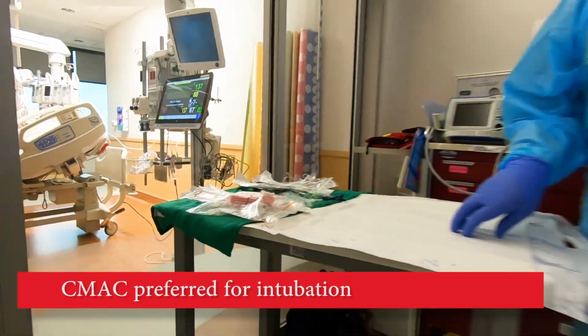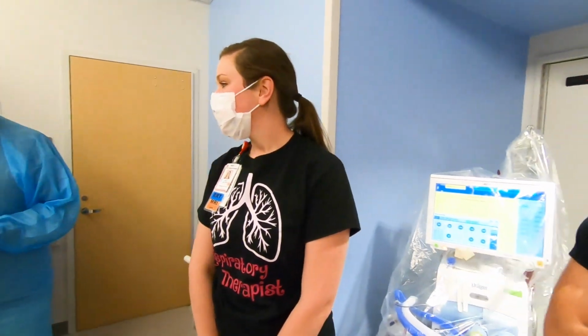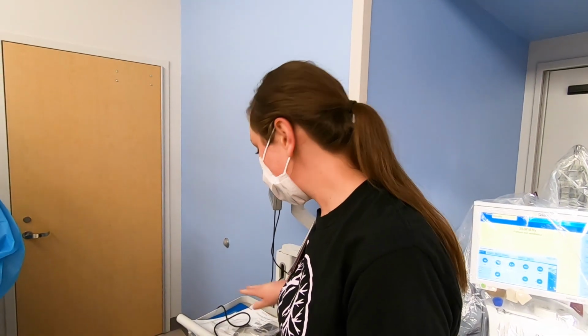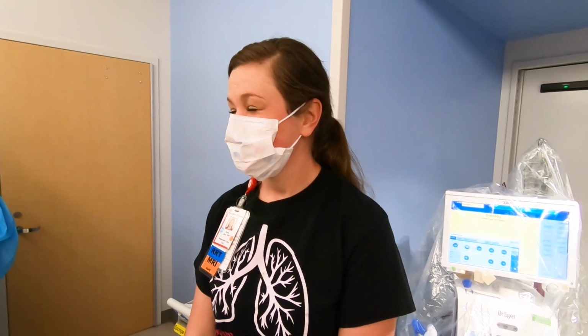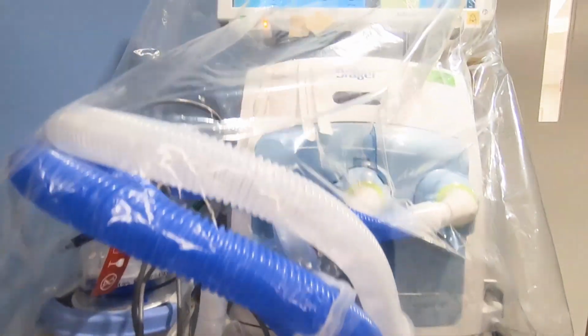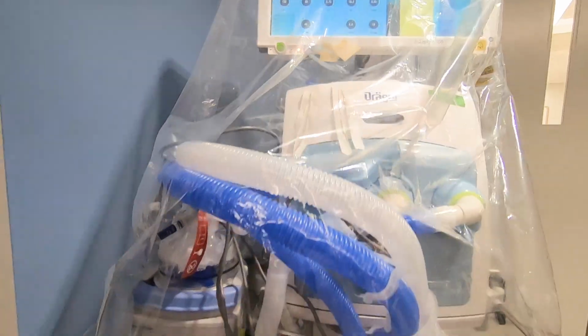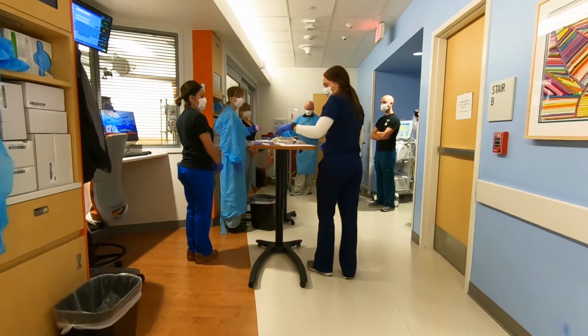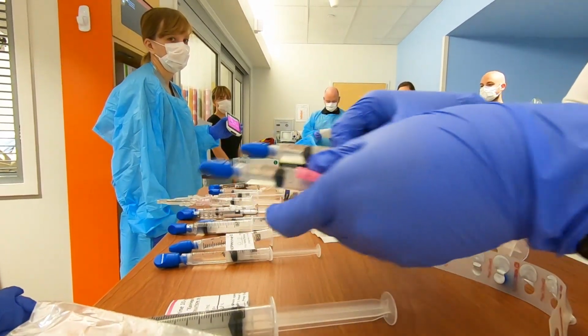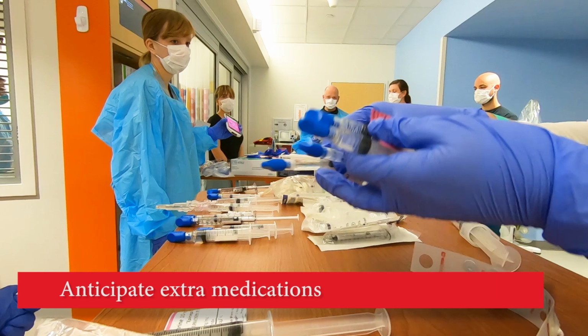So we can just go ahead and do that directly. We also have our CMAC ready to go in the room. Is it a MAC tube? Yes. In place, we have our ventilator set up as well. We have our medications ready. In addition, you will see our pharmacist preparing drugs and medications outside of the room.